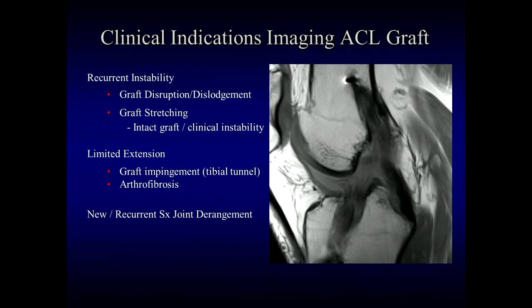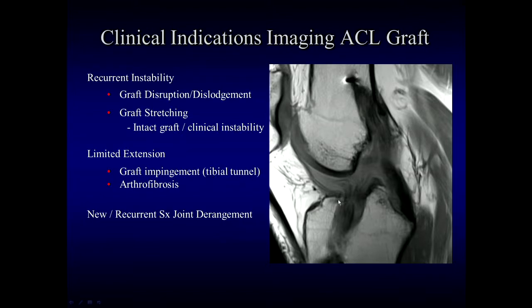Clinical indications for MR imaging after ACL reconstruction include recurrent ACL instability — seen with graft disruption or dislodgement, or with graft stretching where intact graft fibers are visible but the patient has clinical instability. Another major group includes patients with limited terminal extension of the knee, losing the last 5 to 10 degrees of extension, which may be related to anteriorly positioned tibial tunnel causing graft impingement or to arthrofibrosis or cyclops lesion. New or recurrent symptoms of joint derangement can also be assessed in the postoperative setting.